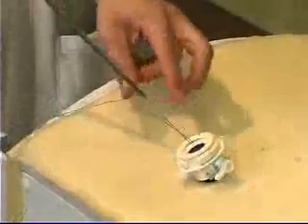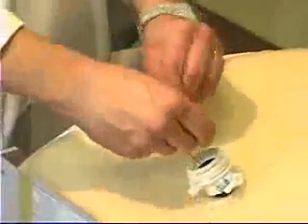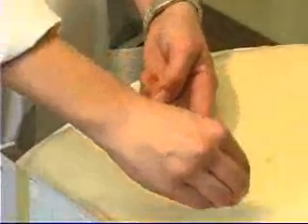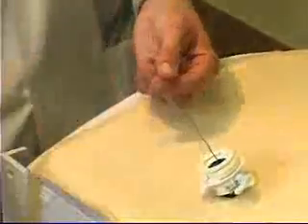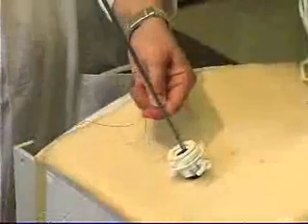The knot pusher is removed and a second throw in the same direction, creating a slip knot, is placed and the knot is cinched down again within the pre-marked area.